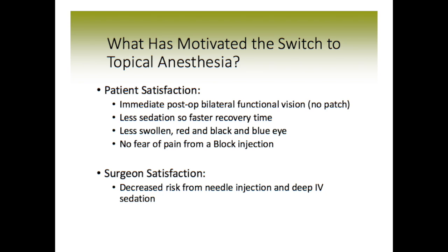And so at the end of the case, we just gently close the lid and place a patch over it so it stays closed, and then that's removed about 4 to 6 hours later. Some surgeons commonly leave it on all day and remove it in the office at the first day post-op visit. But with topical anesthesia, there is no patch required, and you're just up and at it.